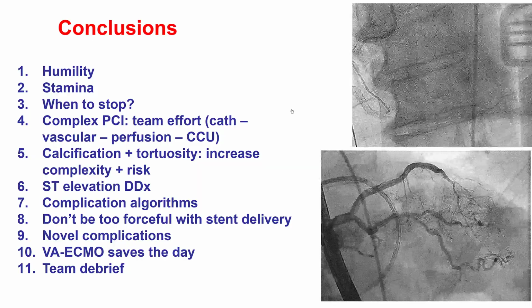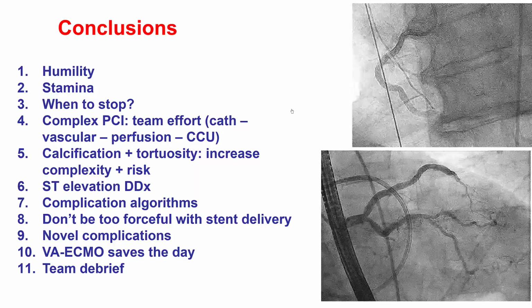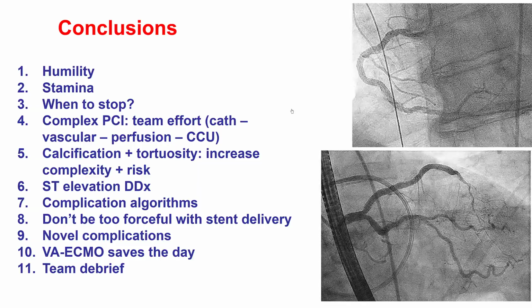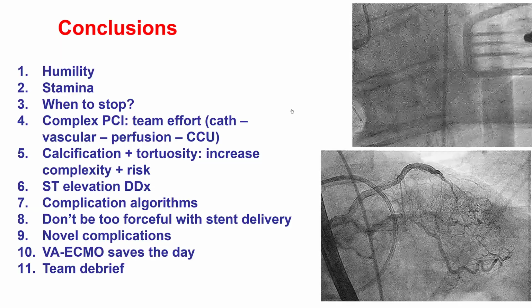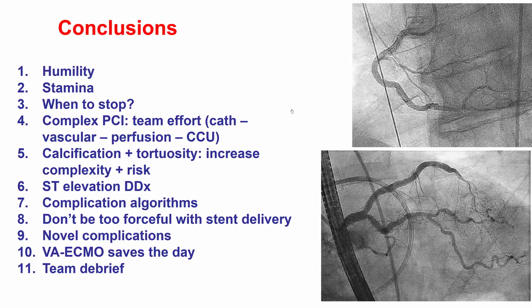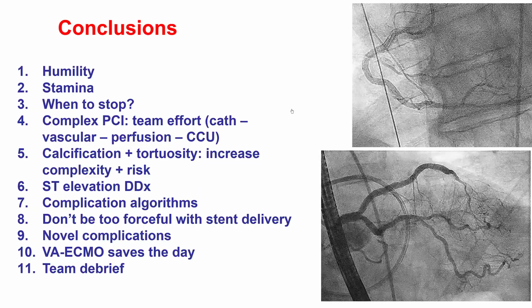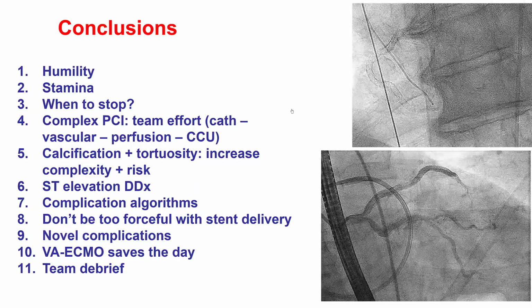So there are multiple lessons from this case for me. One is the importance of humility. This is a case that we never expected to turn out the way it did. There were multiple complications. We did have acute vessel closure.